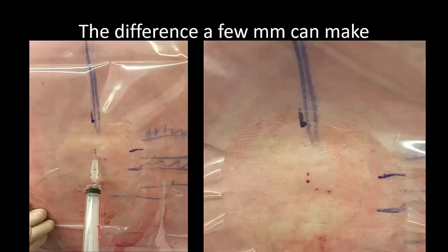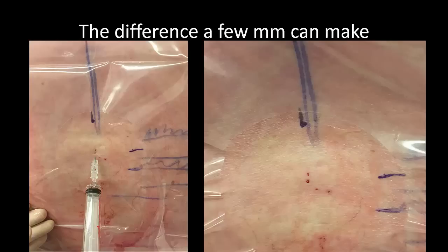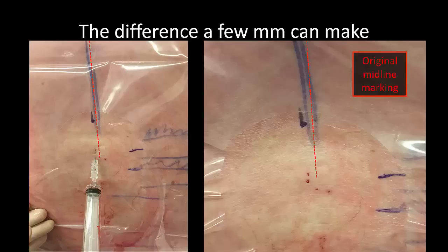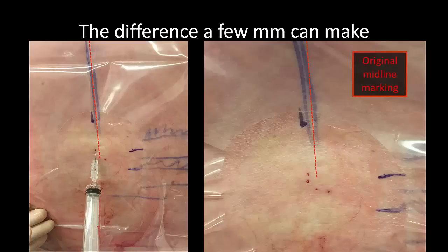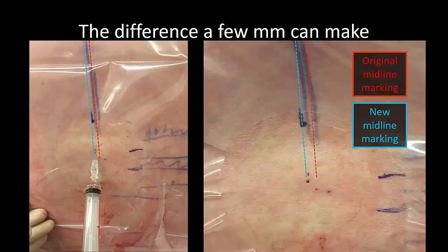To appreciate the difference a few millimeters might make: in one obese older gentleman, we scanned and marked his midline and spaces. Due to a surgical delay, he was allowed to lie back down and was later set up again for the spinal. Initial attempts using the original markings were unsuccessful because the skin was now in a slightly different position and he had very narrow spaces. We rescanned as a rescue, and you can see the difference between failure and success is only a couple of millimeters.